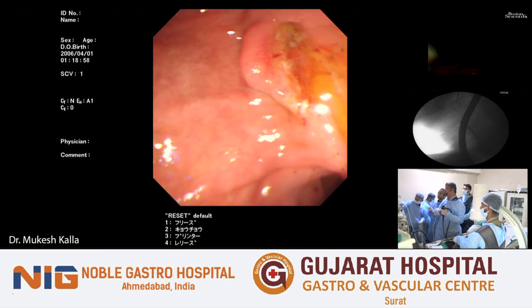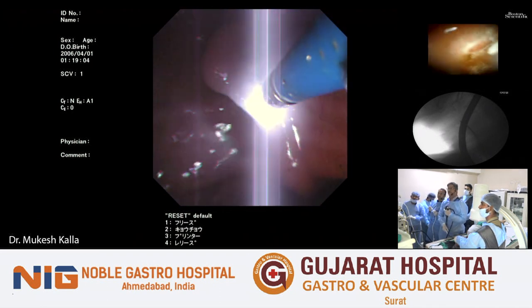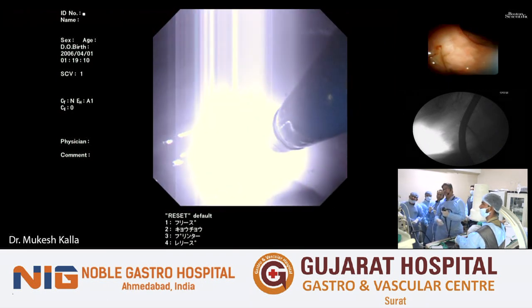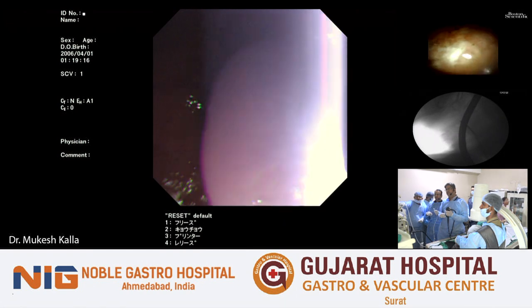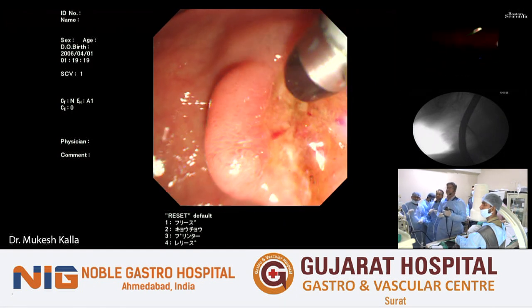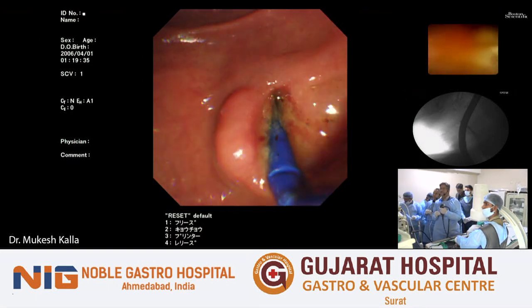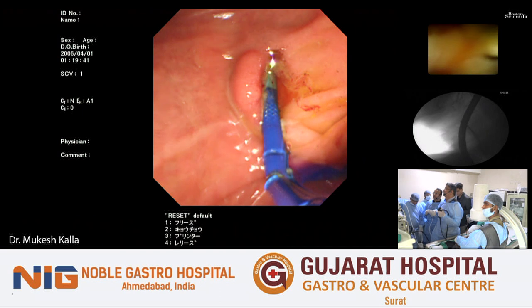So my original question was, would you change some technique or do some additional maneuver if there is any periampullary diverticulum? Periampullary diverticulum. See, we know that a periampullary diverticulum ERCP is a difficult ERCP. So for that particular situation, I would probably advise to keep a wire in, and over the wire we can introduce the scope. Now the first time we had some problem, but now there is no problem at all. The passage is easy because our scope was inside for the last 10 minutes, and it is already locked.